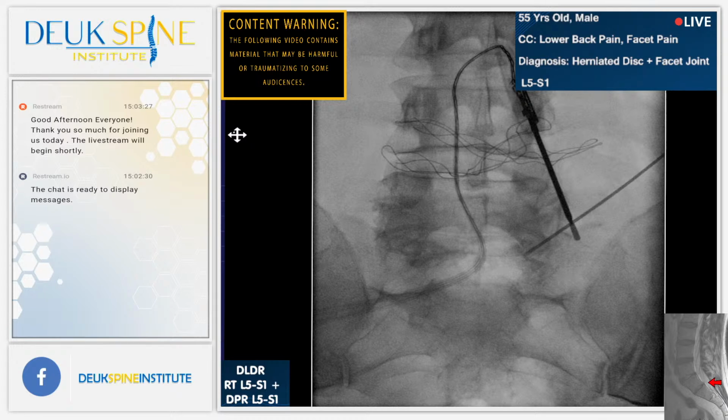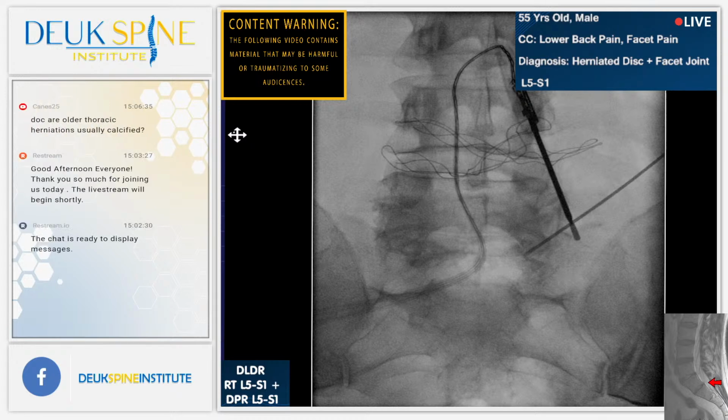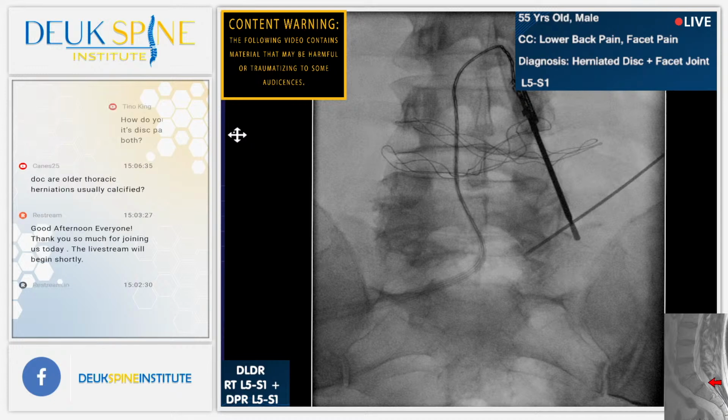That's a nice place. All right, that should be it for the facets.